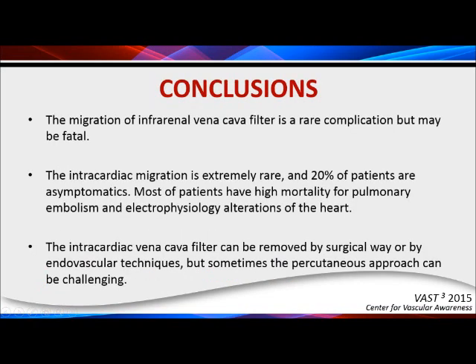Mr. Chairman, the migration of inferior Vena Cava filter is a rare complication but may be fatal. Intracardiac migration is extremely rare and 20% of patients are asymptomatic. Most patients have high mortality from pulmonary embolism and electrophysiology alterations of the heart, and an intracardiac Vena Cava filter can be removed by surgical way or by endovascular techniques, but sometimes the percutaneous approach can be challenging.